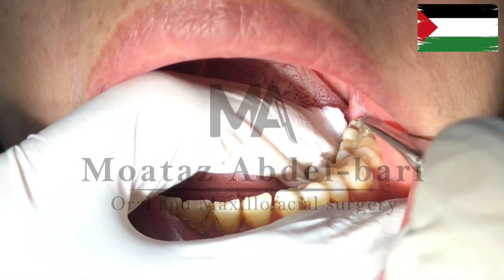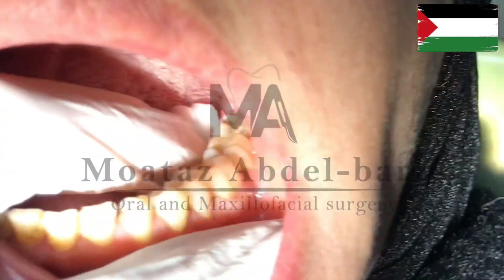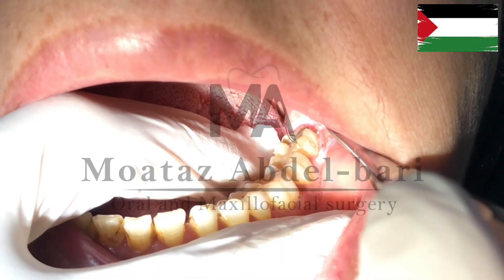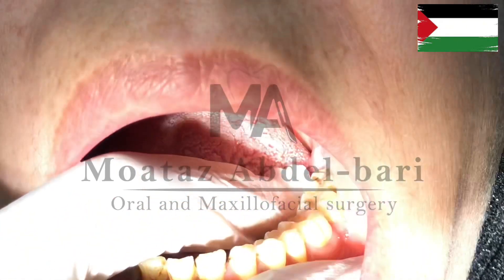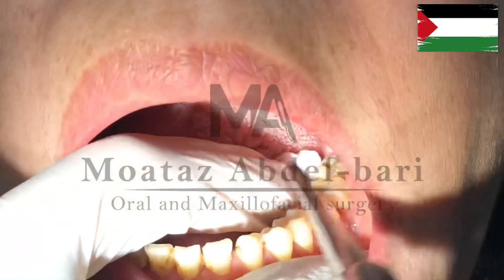Today we are tackling a case of lower third molar extraction without the aid of a radiograph. Observing the cusp morphology, you will notice it is a well-defined cusp resembling those of the lower first molar. This resemblance suggests a potential multi-rooted structure, possibly with two well-defined roots.